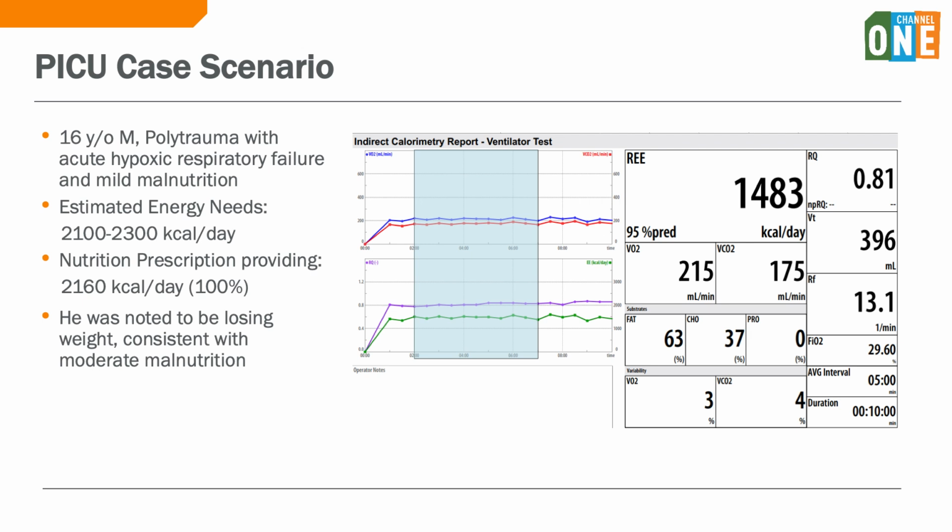There are no red flags in these results suggesting that although the REE is normal, since the nutrition delivery exceeds that considerably, and the RQ is consistent with fat utilization and possible underfeeding, there may be losses or energy expended that is not captured by the REE measurement. In this case, perhaps the periods of neurostorming are increasing the patient's total daily energy expenditure substantially.